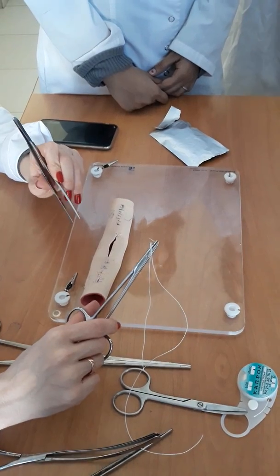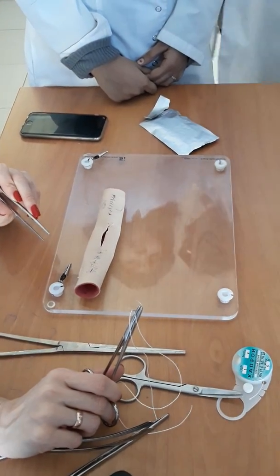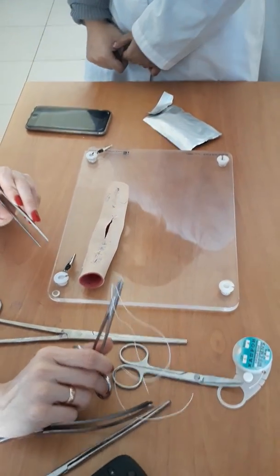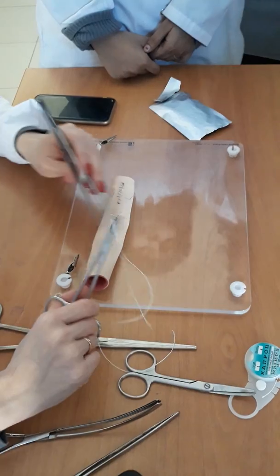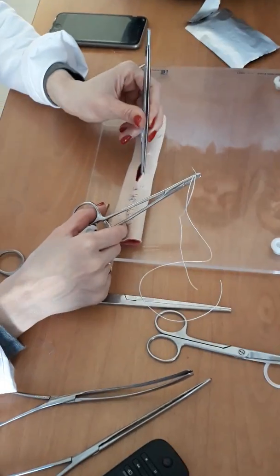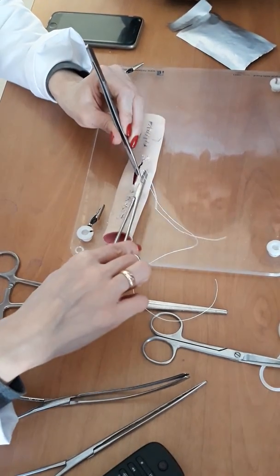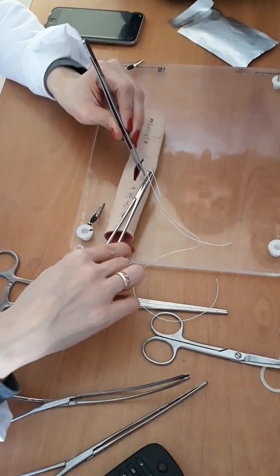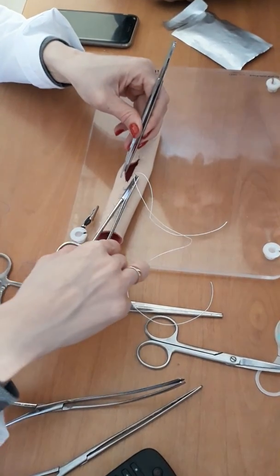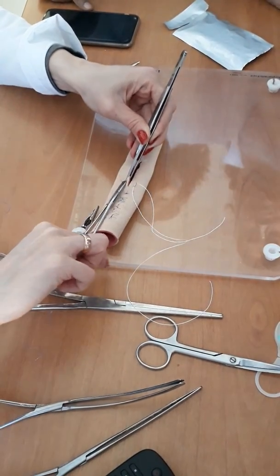At first I will demonstrate interrupted penetrate suturing. It is named the Jolly suturing. And what should you do? You should take one end of the intestinum, step 5 millimeters, pierce, grab the opposite side, also step 5 millimeters, and stitch.